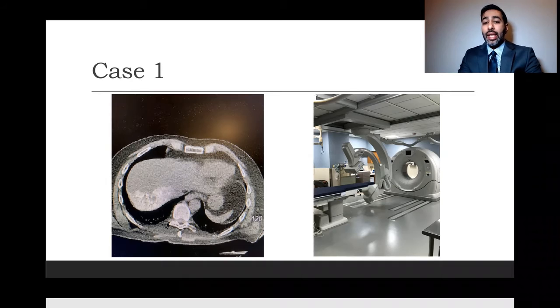We bring in, slide in the CT machine. Literally takes me 2 minutes to do that. Slide out the table and try to get some amazing intraoperative CT images. And that's what we have right here. This is injection showing good opacification and enhancement of the region intended to be embolized, and very selective. Literally took me 5 minutes to do.